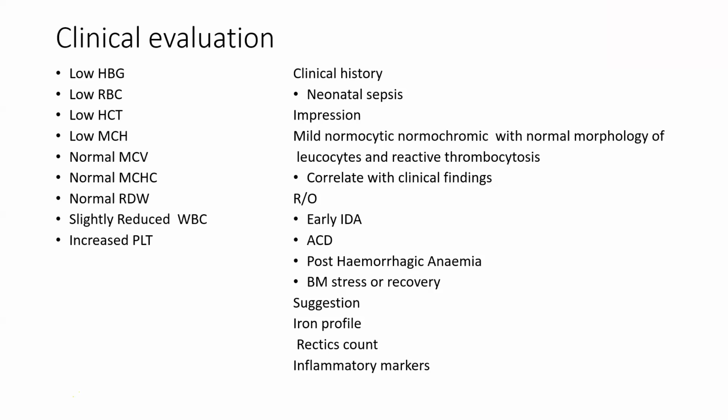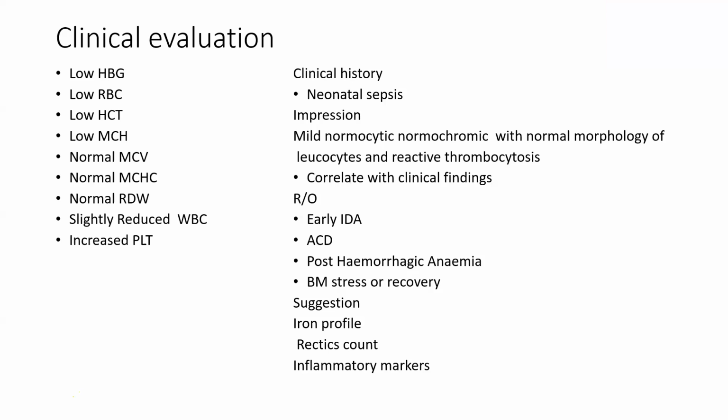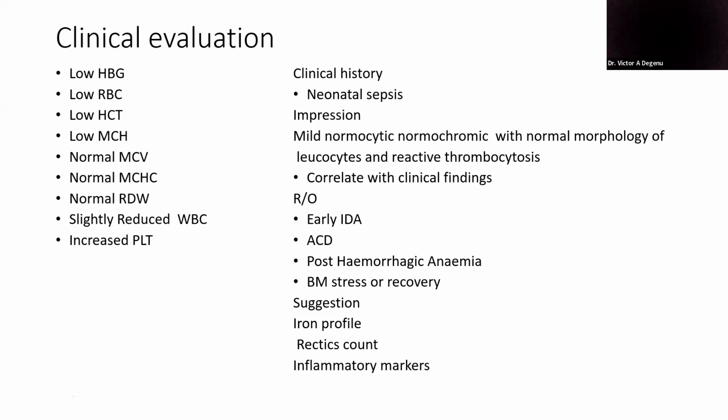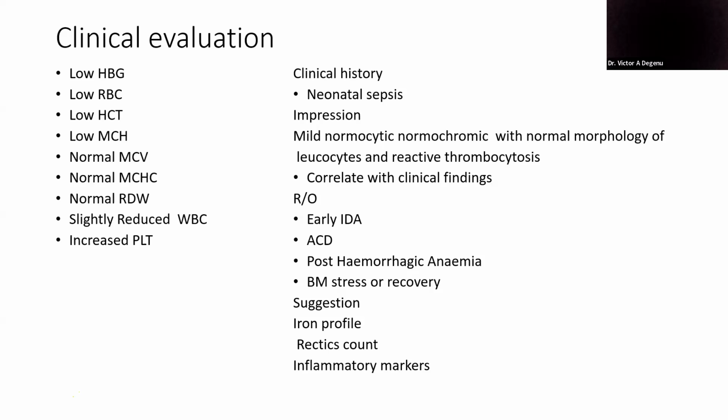It's true. Your first question. You come ask the question, then I'll provide the answers. Okay, the first question. So he was asking why you concluded that the WBC have a normal morphology. And your answer to that was that because it is slightly reduced, you assume it is normal. And I was asking, how about in acute leukemias, where you can have normal to low WBC counts that may come with other abnormal morphology? So how about that? Thank you very much.